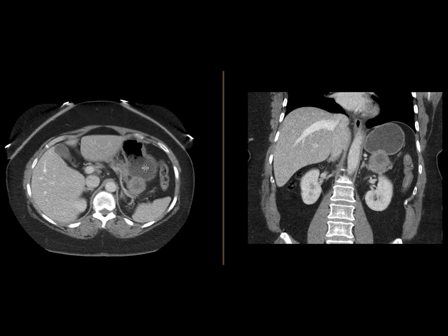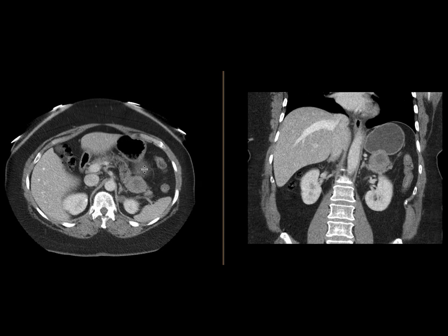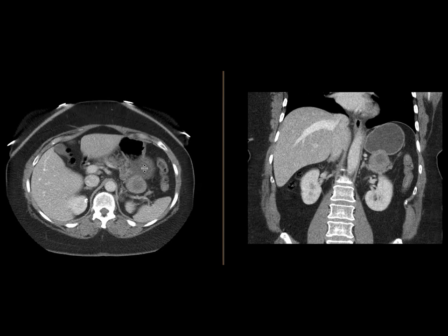The mass itself is somewhat heterogeneous, has soft tissue attenuation, and internally a little bit of lower attenuation associated with it.